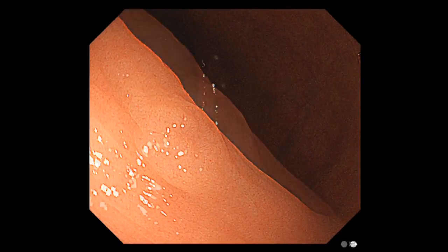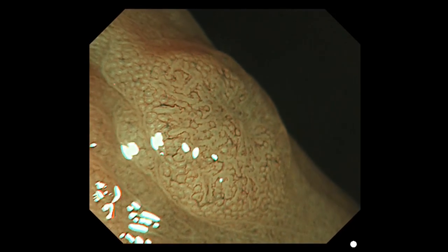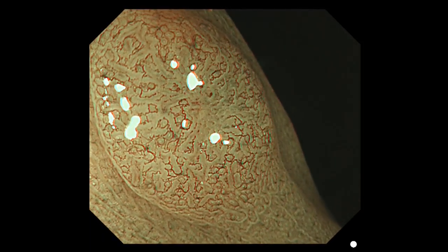This slightly elevated polyp, 5 mm in diameter, has a shallow central depression, also called valley sign. We don't call this polyp depressed type 2C because the depression has a wavy patterned edge and doesn't fall sharply. By zooming in on this lesion, well-ordered reticular or spiral vessels with a regular surface pattern can be observed in the large portion of this polyp. So this lesion is classified as JNET type 2A.